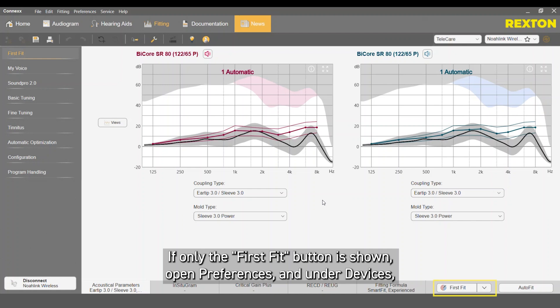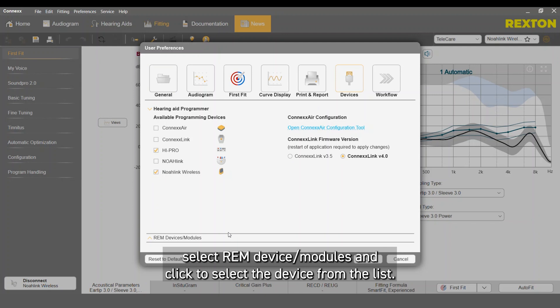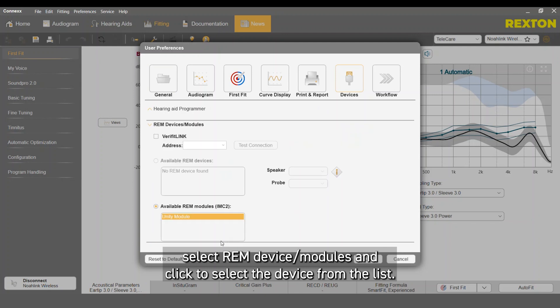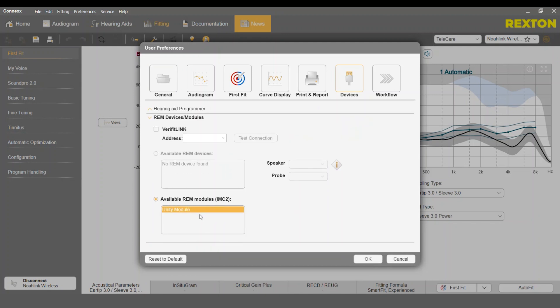If only the FirstFit button is shown, open Preferences and under Devices select REM Device/Modules and click to select the device from the list.